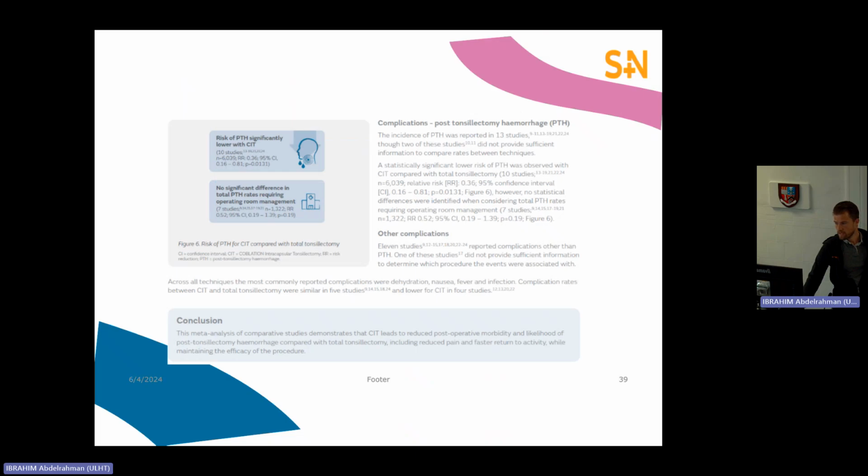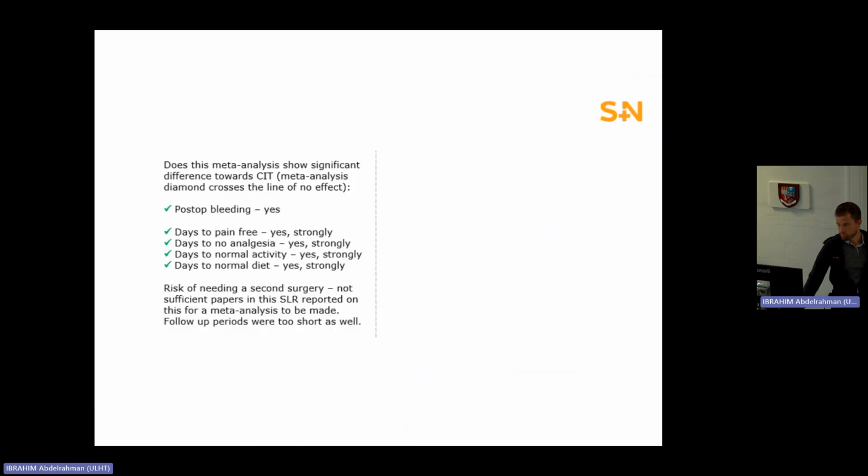And in terms of the bleeding, it was also statistically significant that it was a much reduced risk of any bleeding occurring. But there wasn't enough data to compare a significant difference in total post-tonsillectomy hemorrhage rates by going back to theatre, because there just isn't enough of that data being captured or incidents in the papers to draw that conclusion.